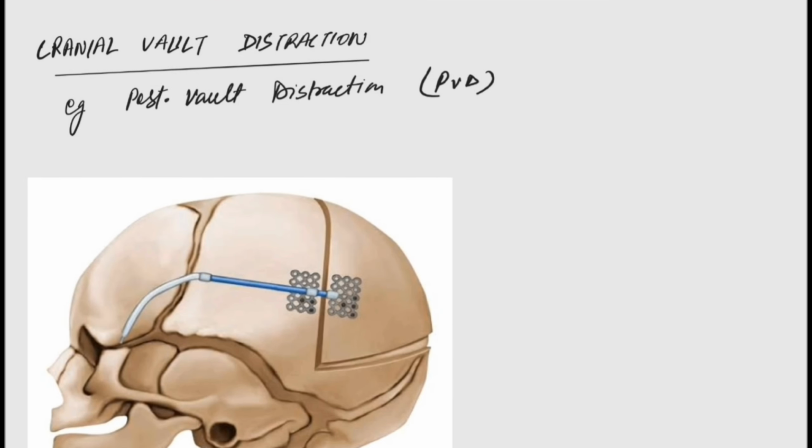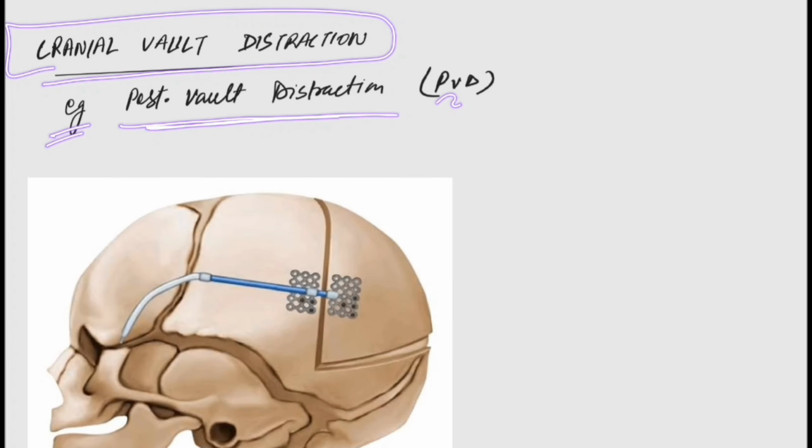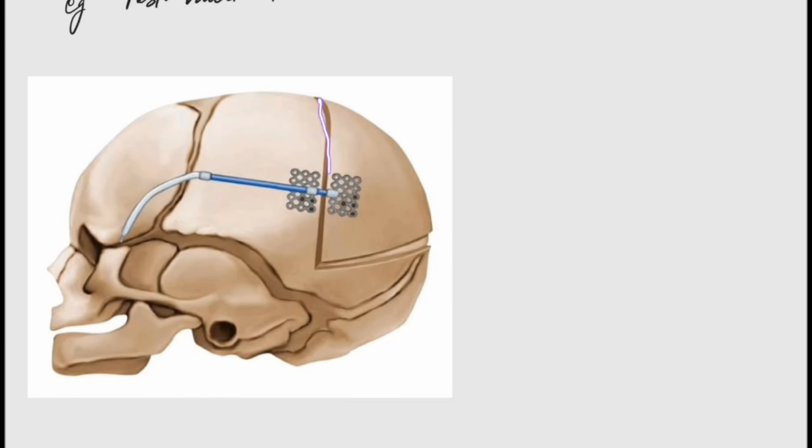Now coming to the cranial vault distraction. Here the most common example is the posterior vault distraction. Here we go for posterior cranial fossa craniotomy and then application of the distractor.